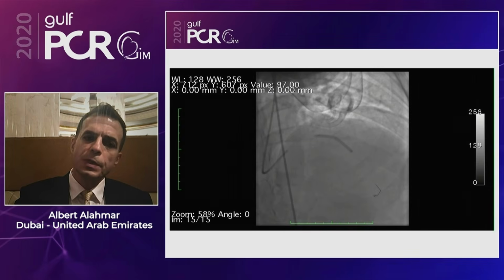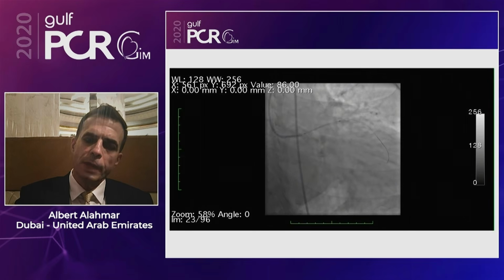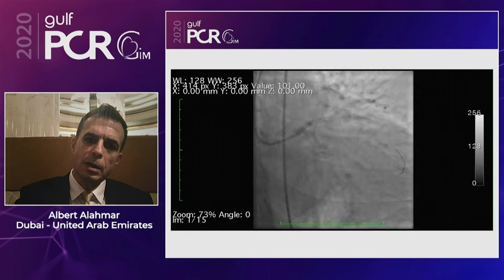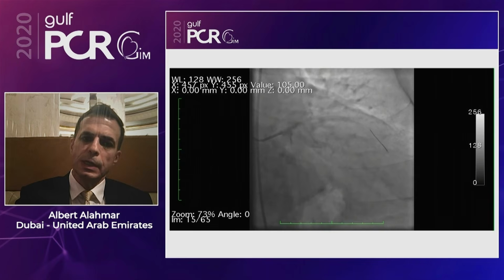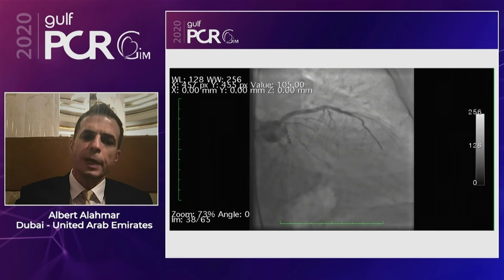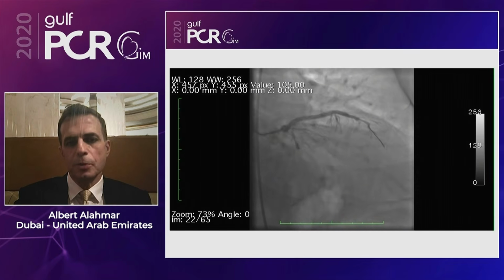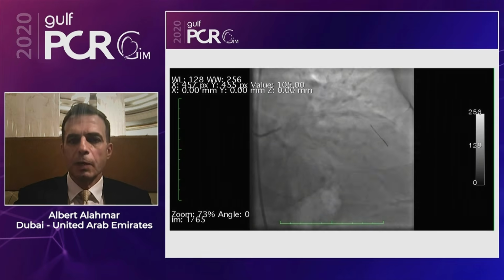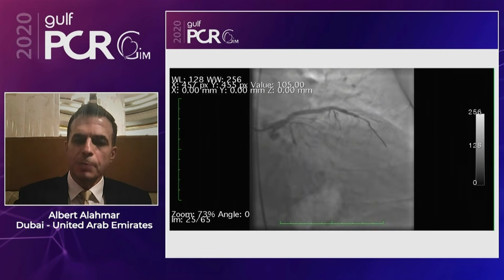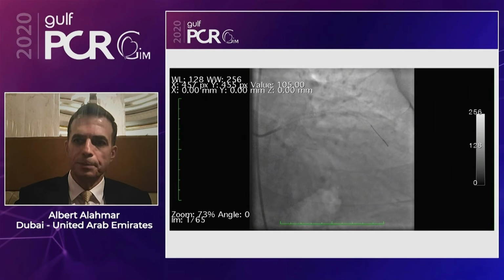Now, following the orbital atherectomy, it was straightforward beyond that point: balloon and stents. We deployed 2 long stents in his case. The one in the left main was at the end with the POT, obviously, towards the end. And you can see the final results in the caudal view and the cranial, demonstrating quite nicely. It would not have been possible to do this without atherectomy, and specifically, I would emphasize in this session, orbital atherectomy.